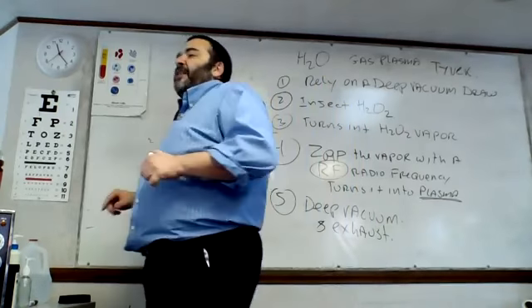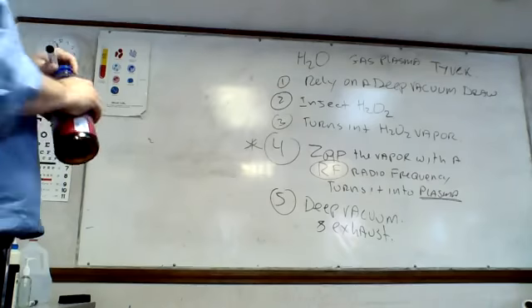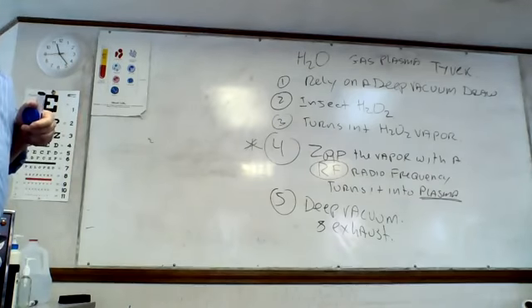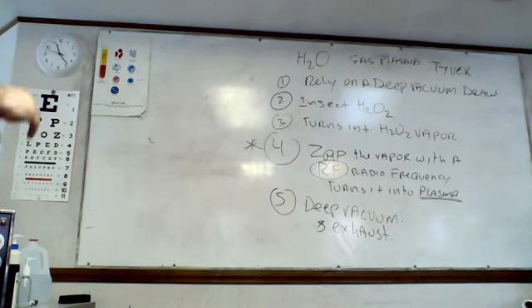And that finishes our cycle with H2O2. How long does it take? Roughly 2 hours altogether. Some advantages, some disadvantages. We already went over that.